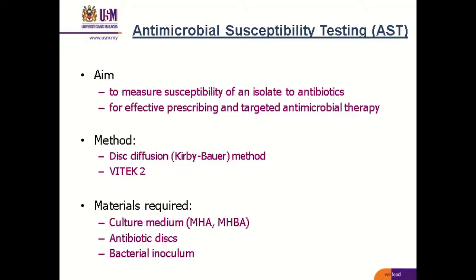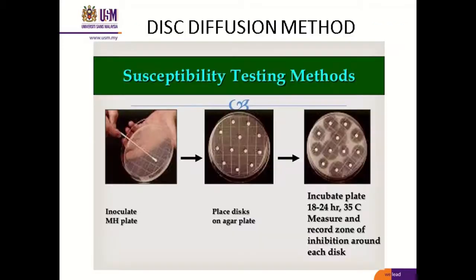For the conventional method, we use Mueller-Hinton agar or Mueller-Hinton blood agar, and the medium is lawned with the bacteria which we have isolated in the culture.